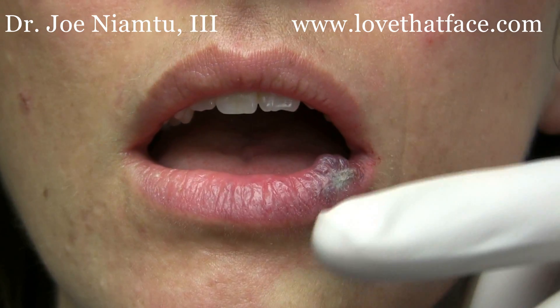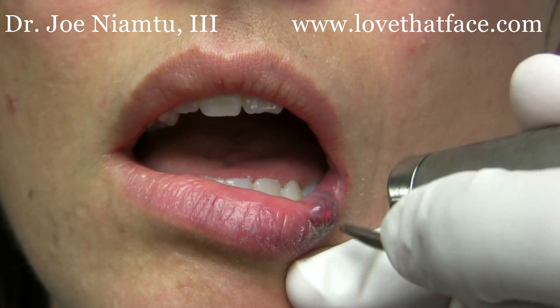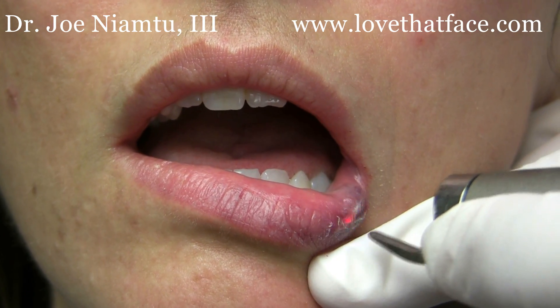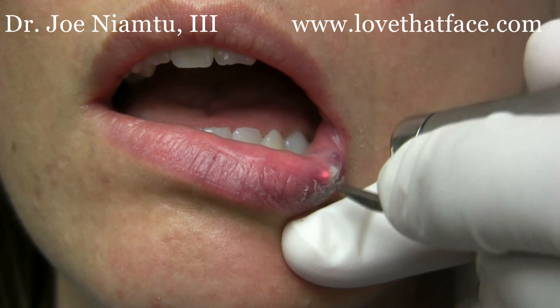Obviously this patient is anesthetized and so we'll probably get at least a 50% resolution with this, and you would tell patients that something of this size would more than likely take numerous treatments.